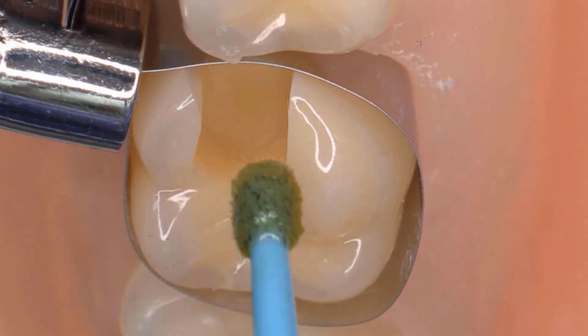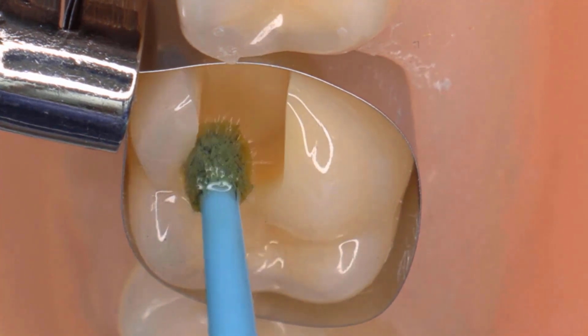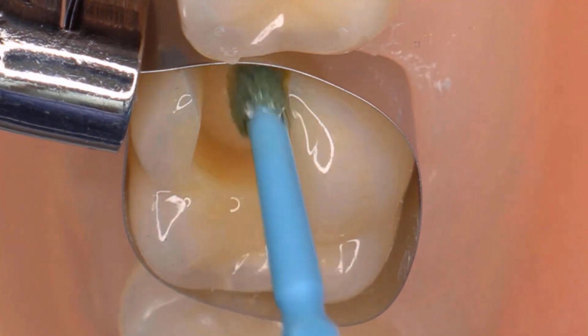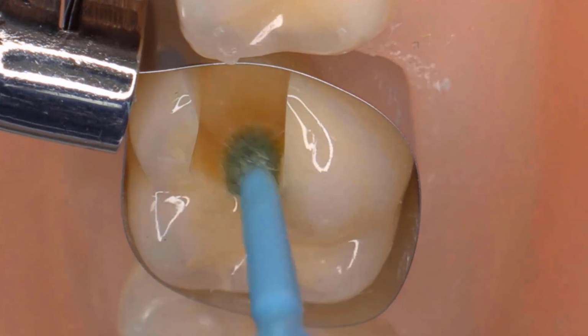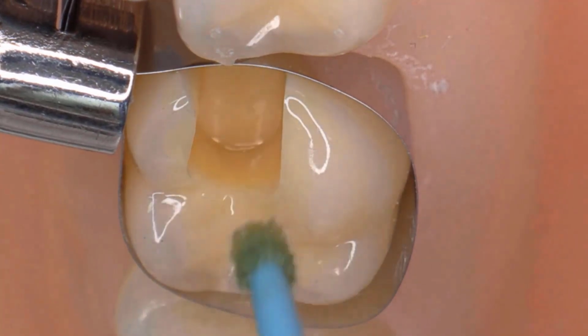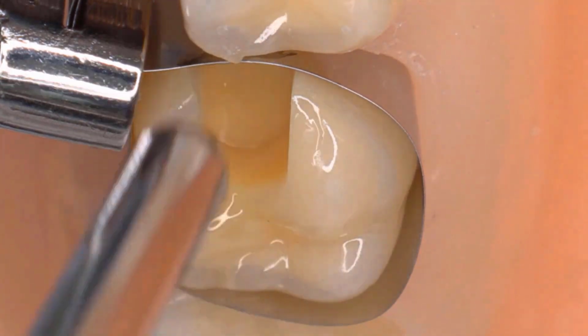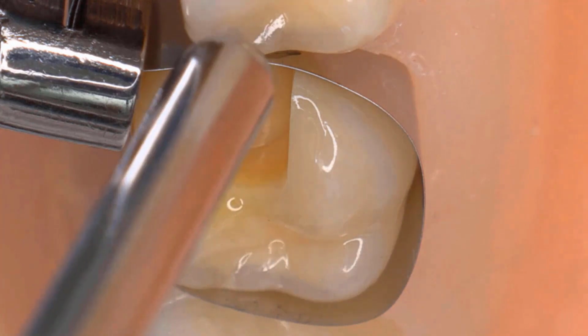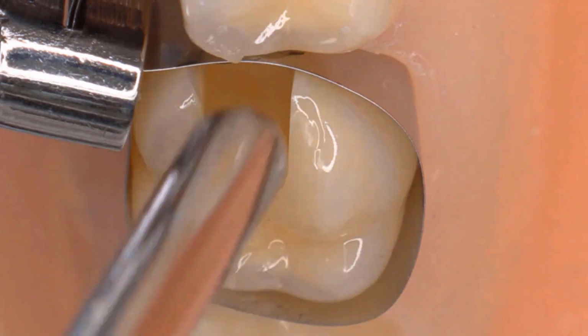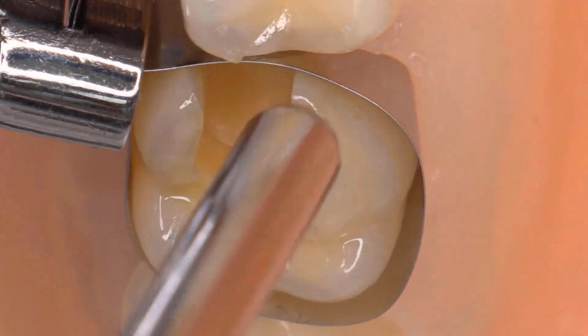Start applying the primer from the enamel and work towards the rest of the cavity. This allows for a longer etching treatment time for the enamel. It is important to actively scrub and agitate the primer for a minimum of 10 seconds. Disperse the liquid with the water and oil-free compressed air until a glossy, thin, immobile layer remains. The primer will begin to self-etch, self-adhere and self-cure.